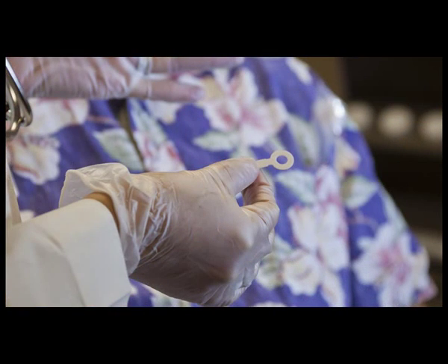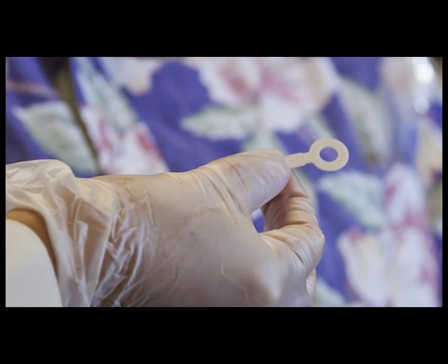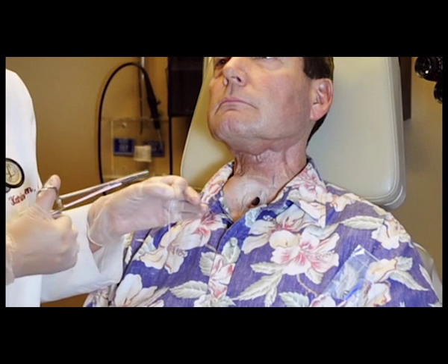So this is the extra flange. It's designed to sit between the tracheal flange and the tracheal mucosa to prevent periprosthetic leakage. This patient has worn one for some time, so we're going to replace it now that we've just replaced his voice prosthesis. You essentially take this and wheel it around the prosthesis, similar to how a tire goes onto a wheel.